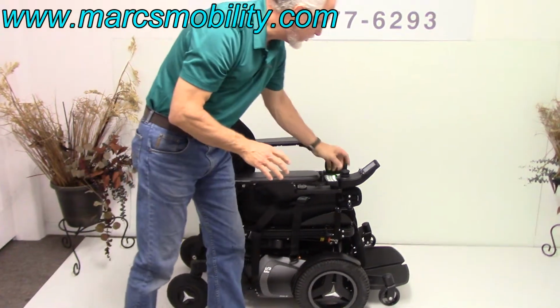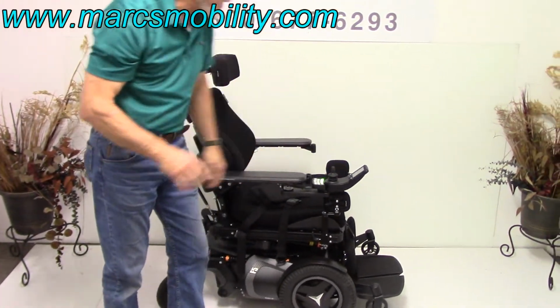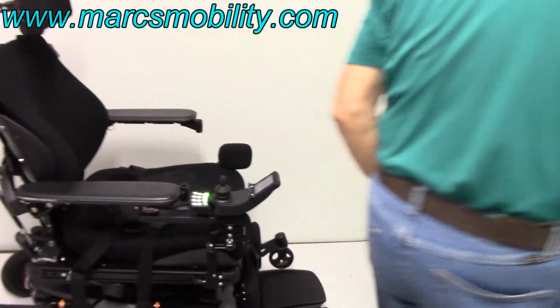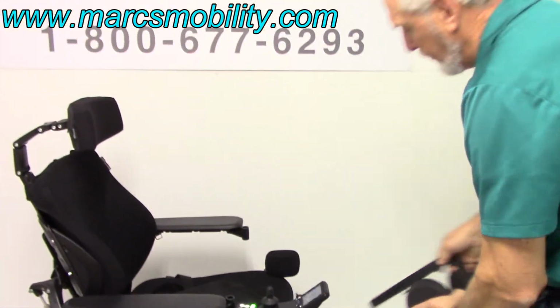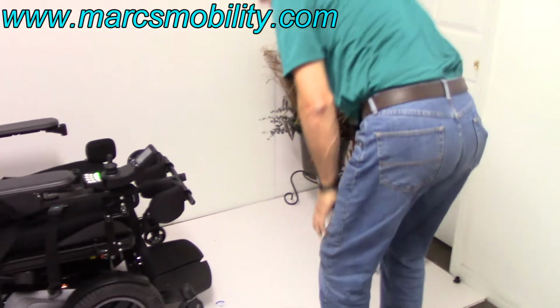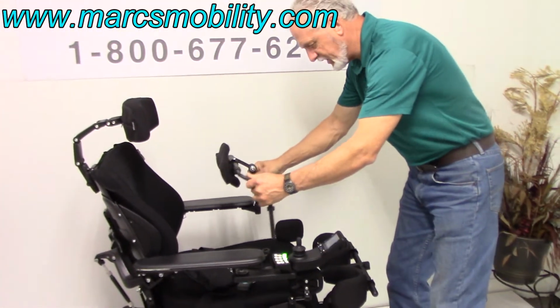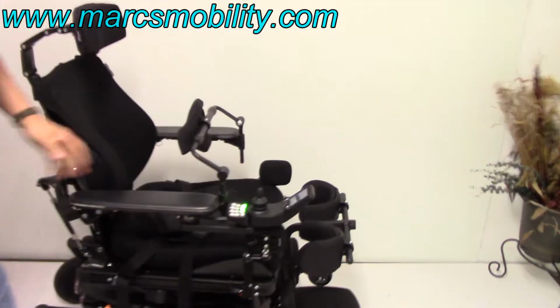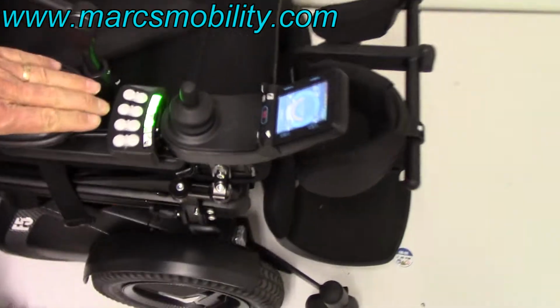But the first thing I'm going to show you, we're going to start right away with the standing feature, which is the one most people want when they're buying this chair. So if you have the standing feature, the first thing you would do before you stand, you'd have to put your knee brace on, and you would have to put your chest guard on, like this and like this. And then you would go right to the control box. You can do it through here or through the switch box.